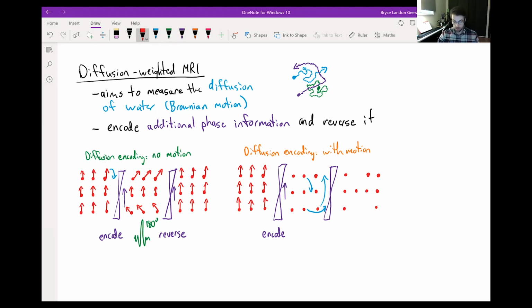That'll mean this top row, again, is going to look the same because I haven't drawn any motion yet. We still have a 3x3 grid. So from top to bottom, ahead, reference, I guess, and behind in phase.